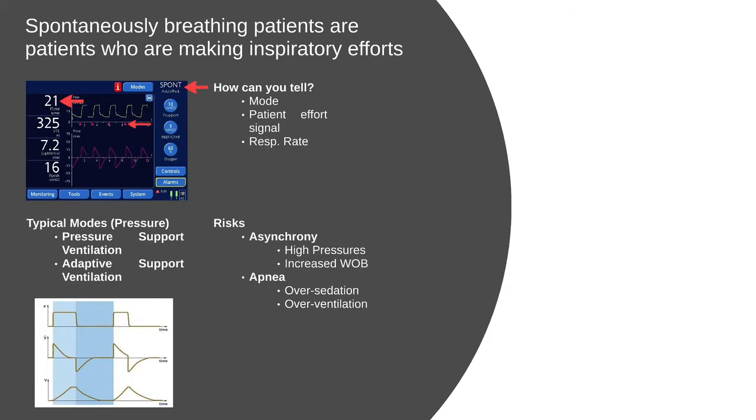And you also have a respiratory rate, because in spontaneous modes, we do not set a respiratory rate. Typical spontaneous modes are pressure support and adaptive support ventilation. Of course, there are risks like asynchrony and apnea.